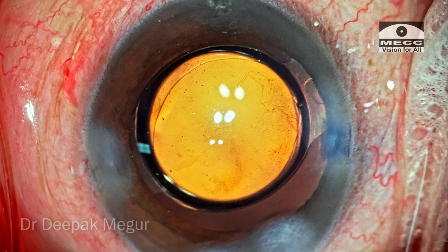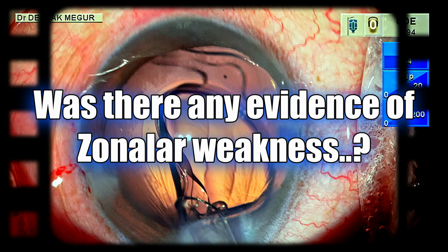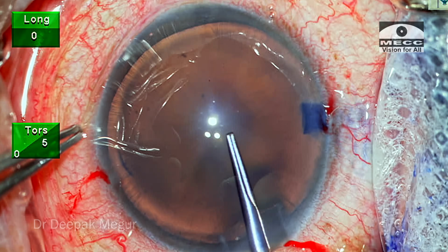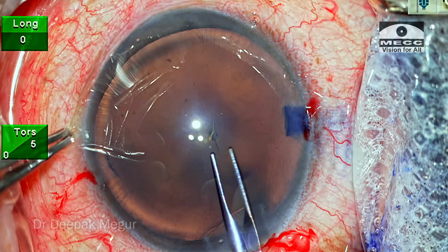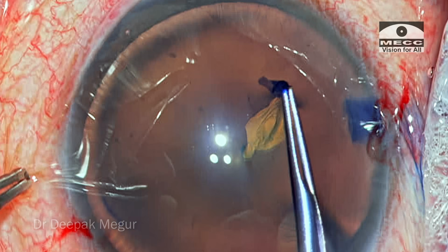So there's a small lesson to learn. I just went back and rewound the entire video and saw was there any evidence of zonular weakness which I missed. So just go in and see whether during the puncture am I able to see any wrinkling. There's hardly any. There is just a little bit of a hint. And when trying to tear the capsule, there are a couple of folds.